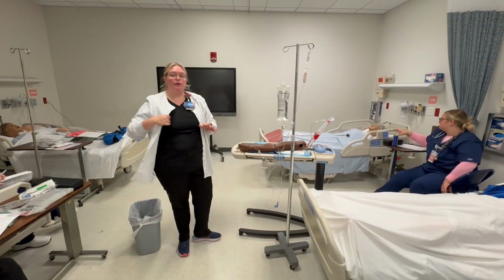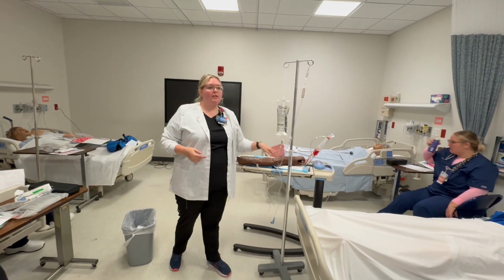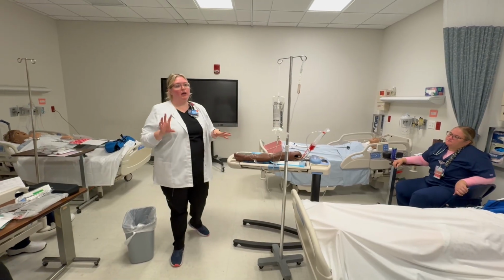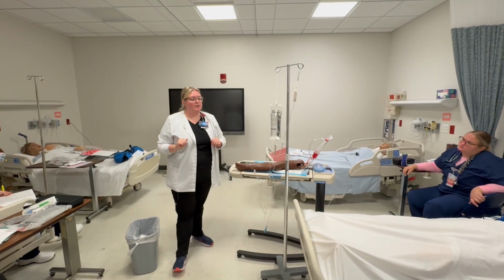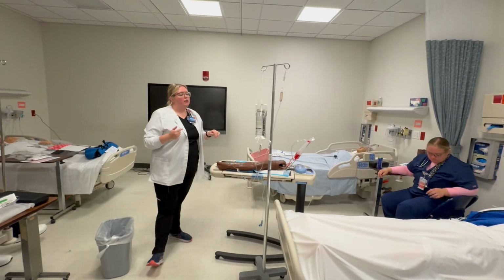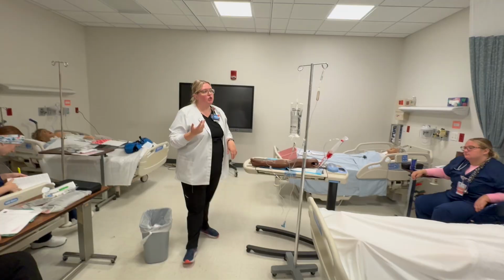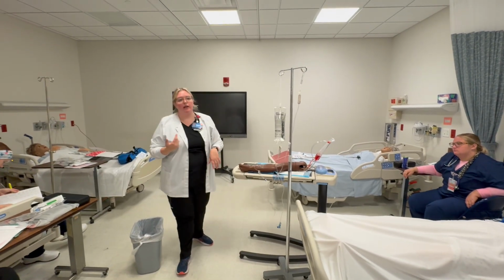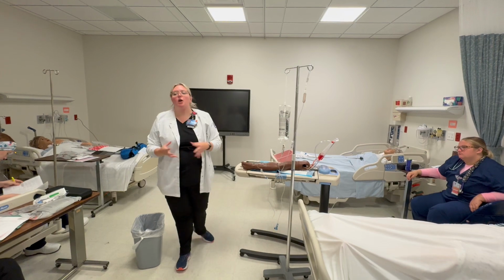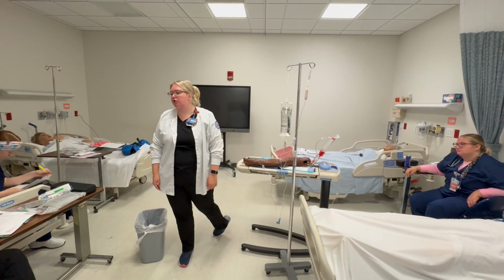What else? Anybody else have any questions? We have to label tubing. How long is tubing good for? What does ATI say? 96 hours. Facilities are going to have different policies based on that. So you want to label your tubing. We're also checking expiration dates on things, checking color and clarity, making sure nothing's expired, checking all the checks. Okay? What questions do you guys have?